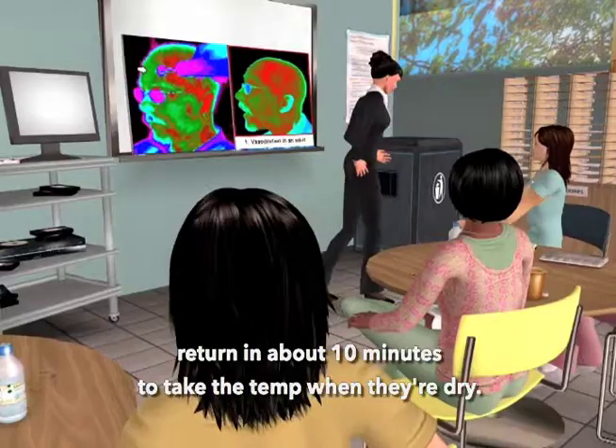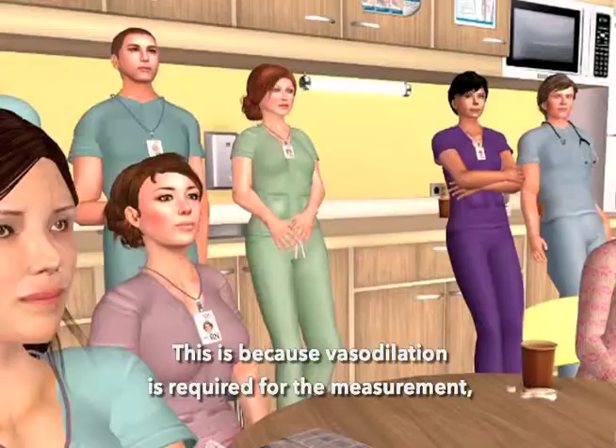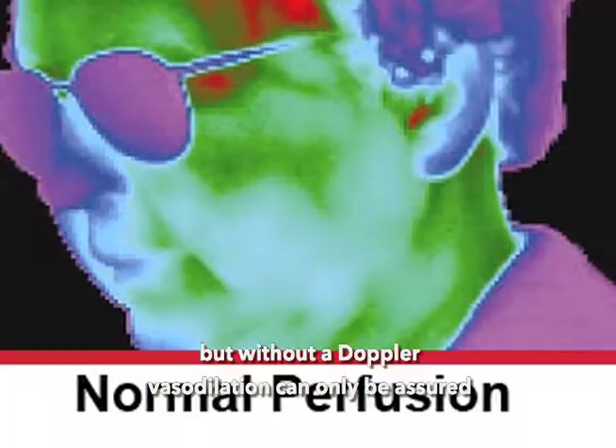Can we just take the temp on the neck behind the earlobe? It's a good question, but the answer is no. This is because vasodilation is required for the measurement. But without a Doppler, vasodilation can only be assured in the presence of diaphoresis or head trauma.